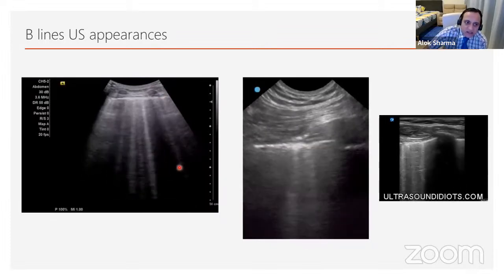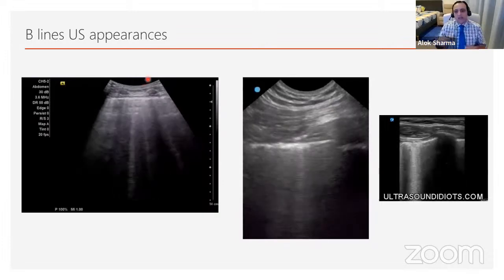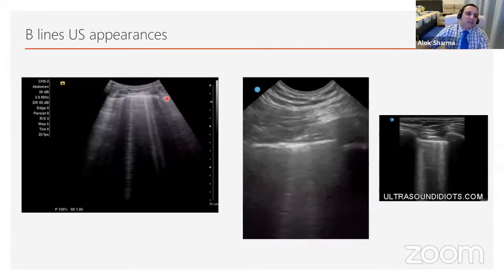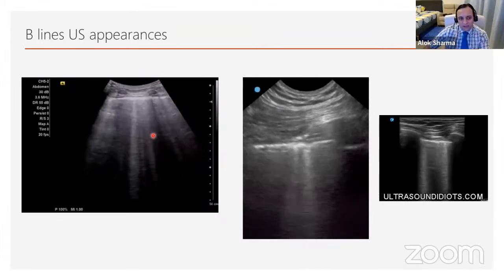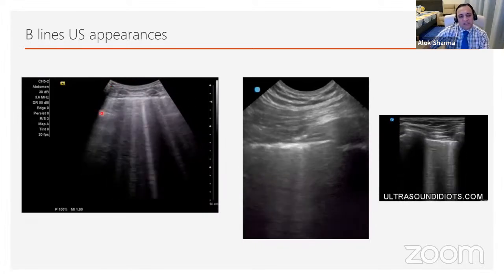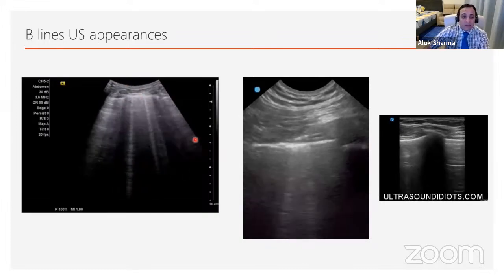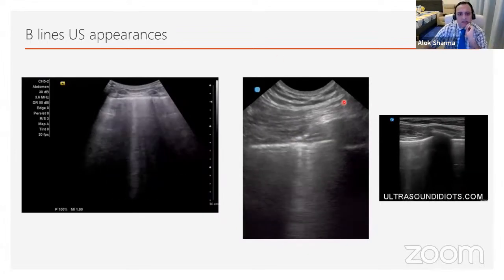And what you're having is basically attenuation, because the ultrasound waves are maximally concentrated. And this is why I would say using a hockey stick or a linear probe is better. The reason I'm showing you the slide is because you can easily see that if you used a linear probe or a hockey stick, here it's quite clear this is a B profile. But using a phased array probe, you might miss these B lines and see just one or two B lines and actually think this is an A dominant profile, whereas it's wet. So that's how the difference in probes can actually alter the ultrasound appearances.